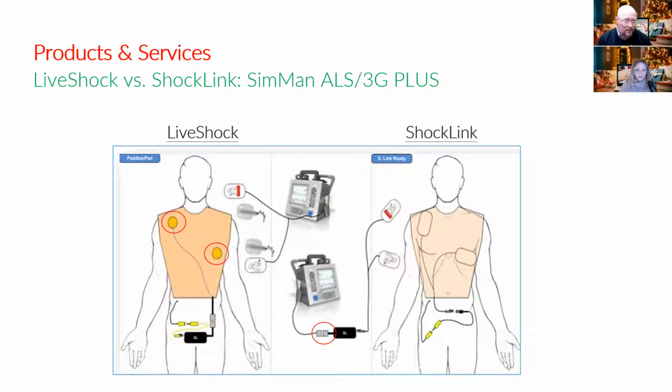Those gold discs go down into a thermal resistor, which absorbs the energy and dissipates it as heat. So we definitely remind people, don't shock more than once per minute. If you go through any of the new ACLS guidelines, the algorithms don't line up, because after a shock now we're doing 2 minutes of CPR. Just be cautious that when you're using 200 joules or 360 joules, you allow at least a minute for the thermal resistor to dissipate the heat to accept another shock.